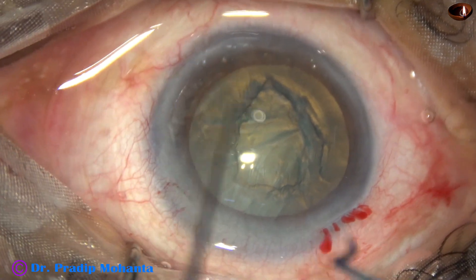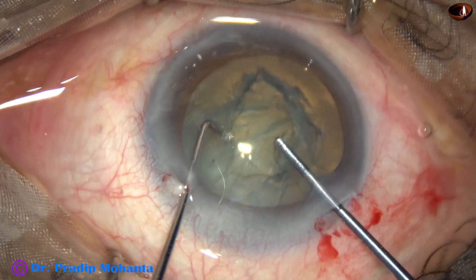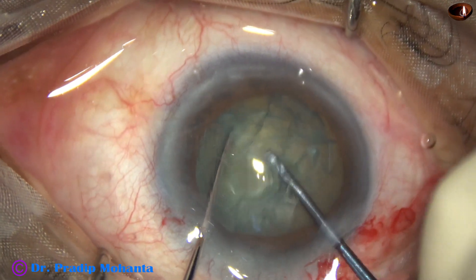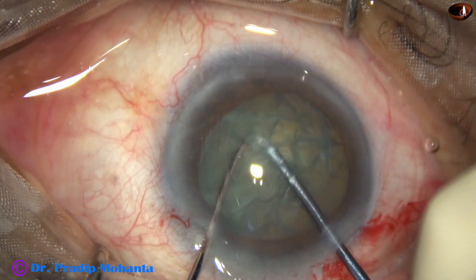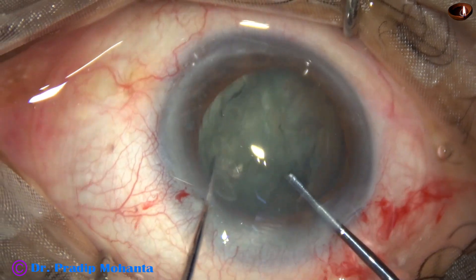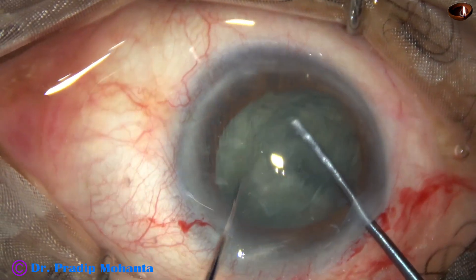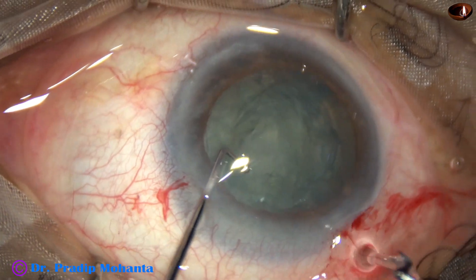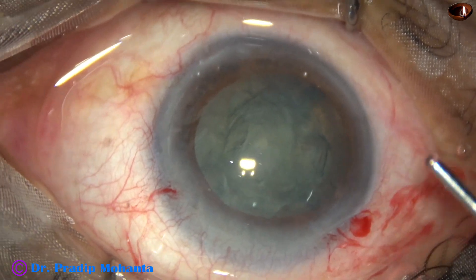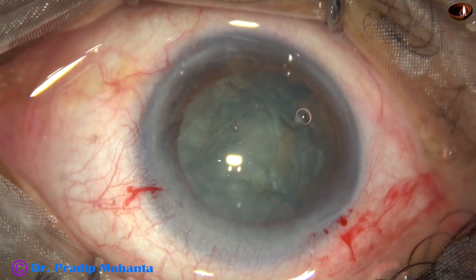Now I am going to use a pre-chopper to divide the nucleus into some pieces. This is the first maneuver — we get two hemi-nuclei, and then one hemi-nucleus is divided into two pieces. This pre-chopper was designed by Dr. Sohail Irfan Khan from Nanded, Maharashtra, India.